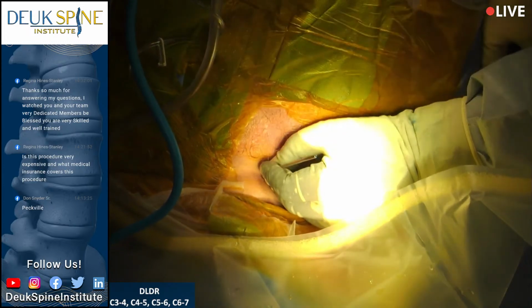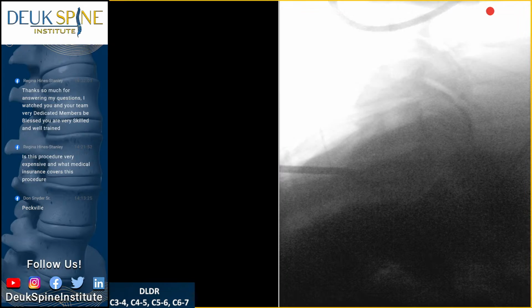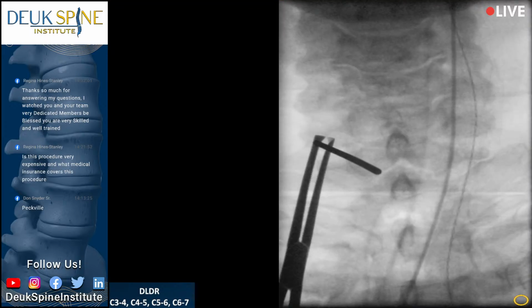All right, AP. You guys are doing great. I apologize it's taking so long, but this is our last shot at getting this done right. And maybe I'm past the bone spur right now. Off to my side, that's the problem. Stay where you are.